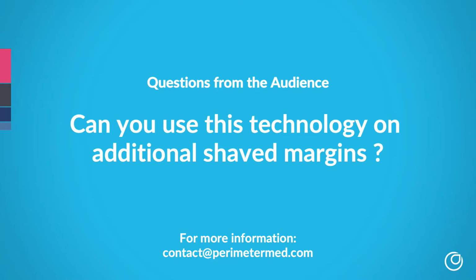And maybe the thing just to recognize is that the margin you want to image is the new margin, and that's what needs to go face down on the scanning surface. And that takes a little bit of thought, but it gives you a very clear view of your true margin, if you like.